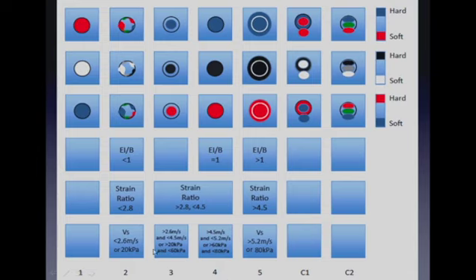And then if we go between 20 and 60, most of those are benign, but there may be some malignancies based on papers in the literature, so I gave that a 3. And again, I think that now we're able to take all of the methods and come up with a unified method of evaluating breast cancers and showing that these are all somewhat related, as we're all measuring the same factor, that is the stiffness of the cancer.